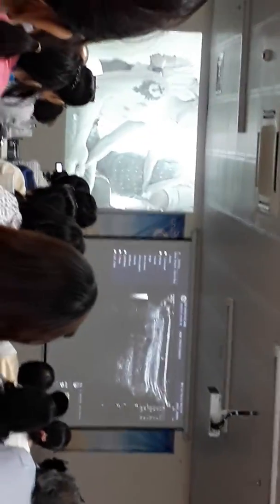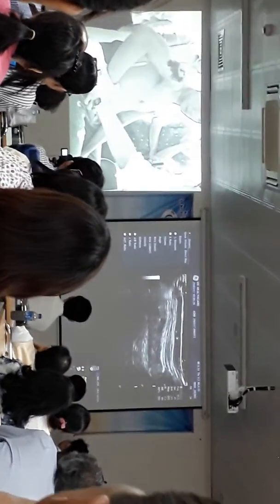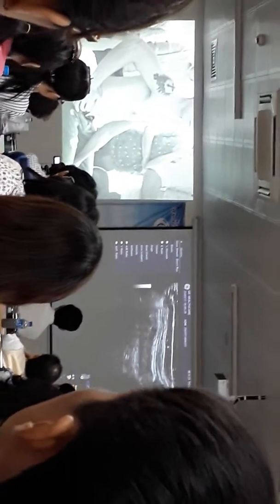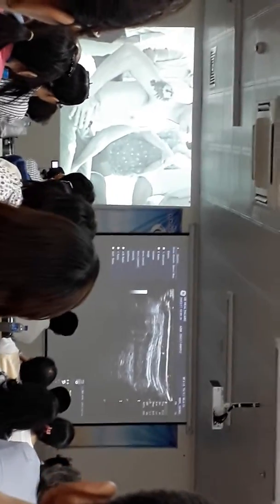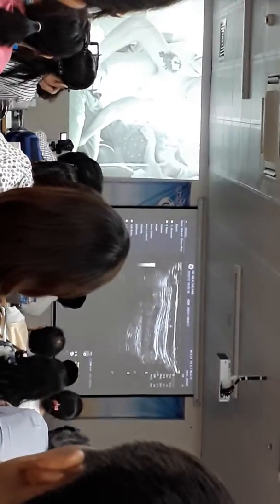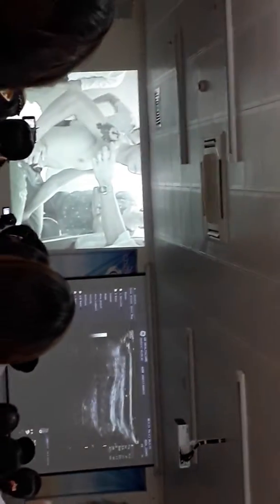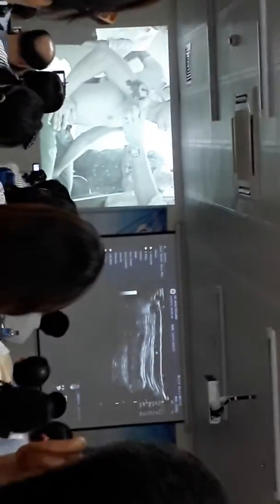So to do this, I get the patient to pop their hand on their hip, like resting on the back. So just get their hand, don't get them like that. Get them so their hand and thumb are facing all forward. And then you just gently push the patient's elbow back.